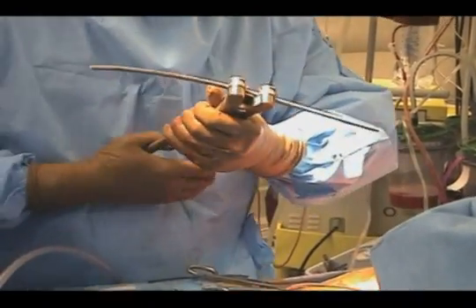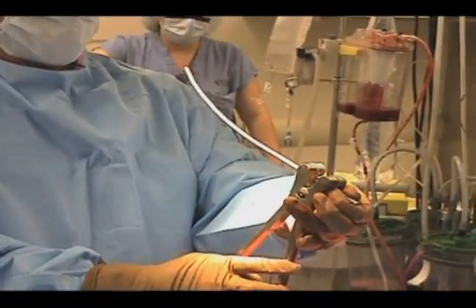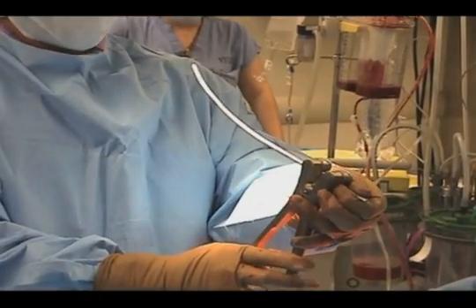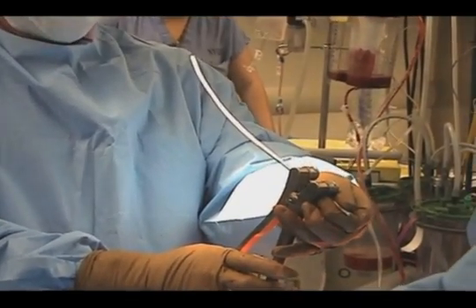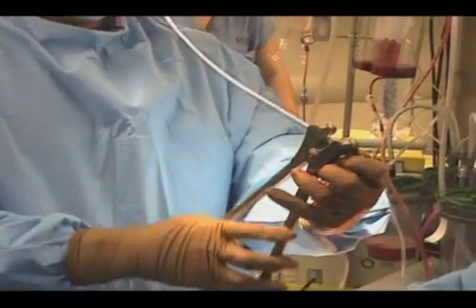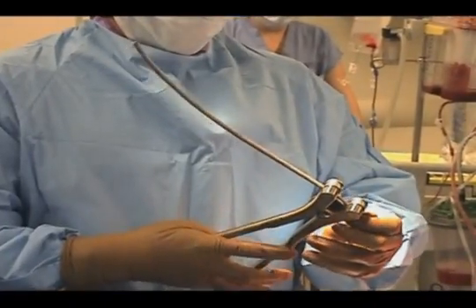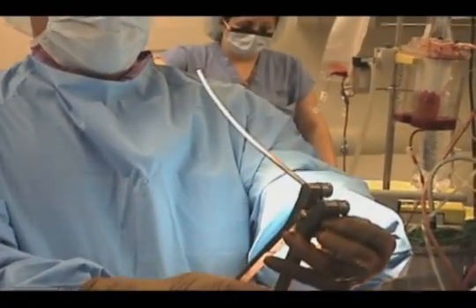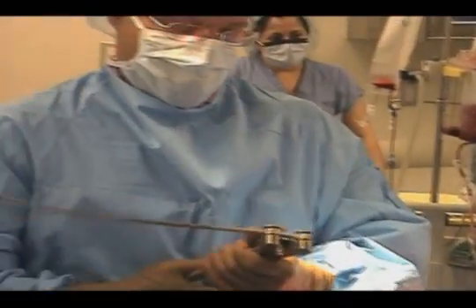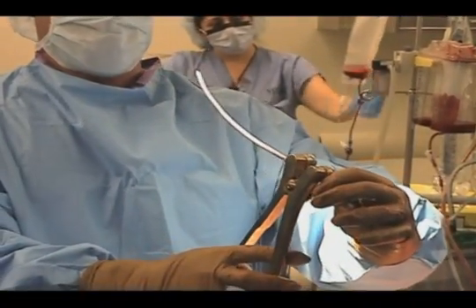Patients have a pelvic incidence that's innate to them, and that dials in lordosis. So we look at pelvic incidence to give us a sense of what their lordosis and then secondarily what their kyphosis should look like. But we clearly want to reestablish kyphosis as part of our treatment. That enhances lung volumes or chest cavity volume, and we add a little bit of lordosis for the distal aspect here of the construct, because we do go into the lumbar spine here in this particular case, just at the proximal end of the lumbar spine.